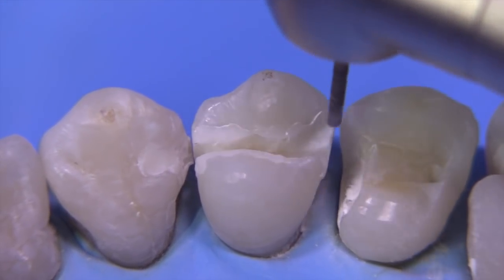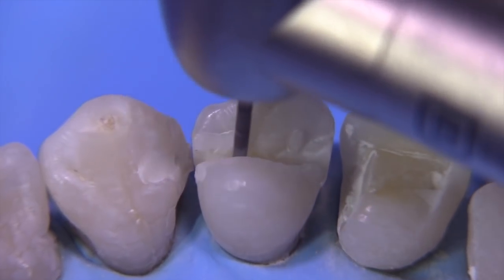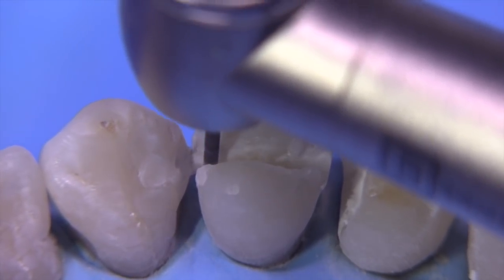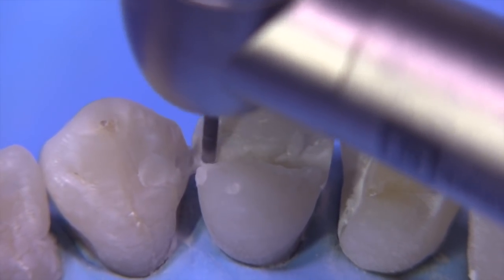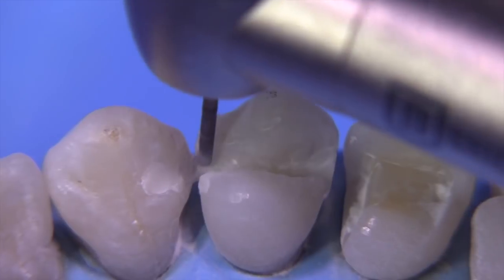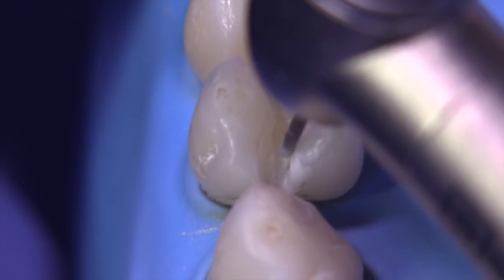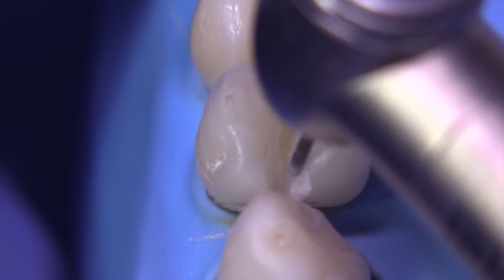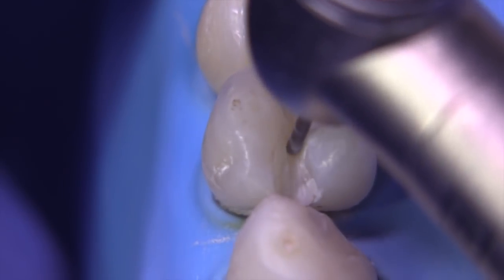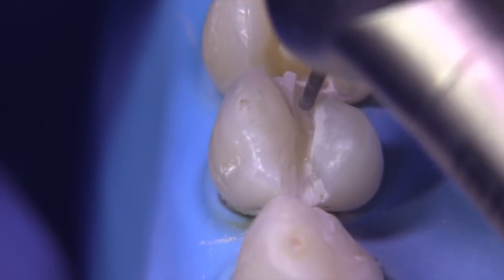In this particular case, we're just going to go ahead and pretend like we were going to drop boxes. We're going to create our flares in the normal manner, being really careful on that mesial facial for aesthetic purposes. We're looking for about 11 or 12 degrees of total occlusal divergence. That's about the same divergence that you would see in a Dixie cup. Once again, we're not dropping the box now; we're just working on the occlusal portion to get the proper draw.